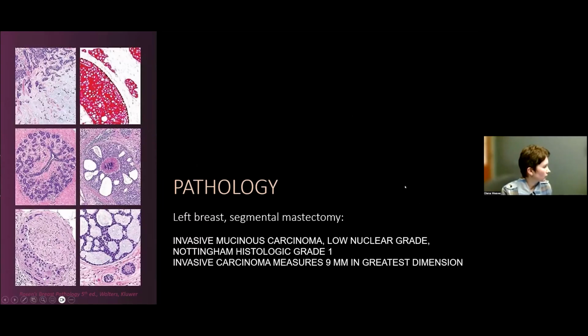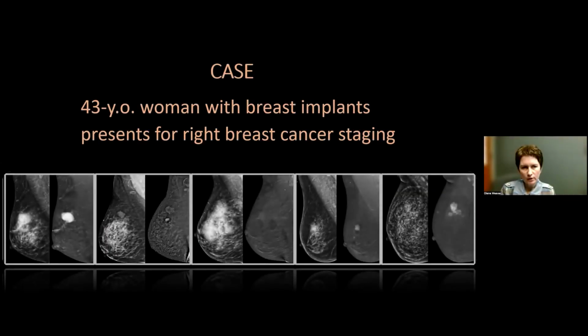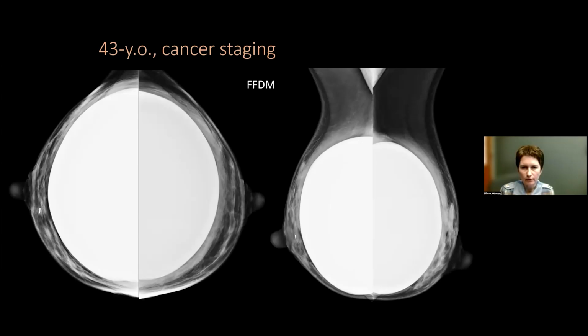It was a low-grade mucinous cancer, 9 millimeter on pathology. Now we have a 43-year-old woman with breast implants who presents for right breast cancer staging. These are full-field digital mammograms.